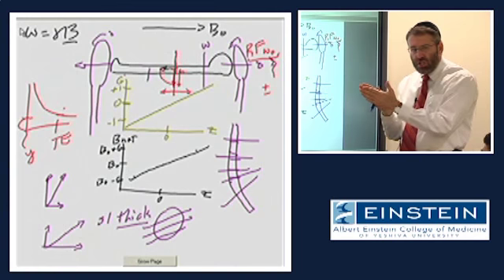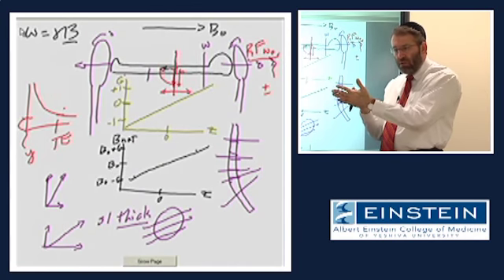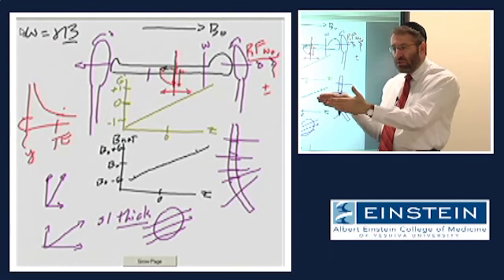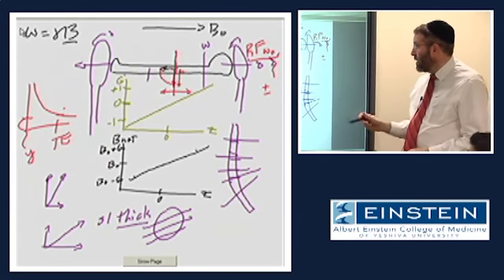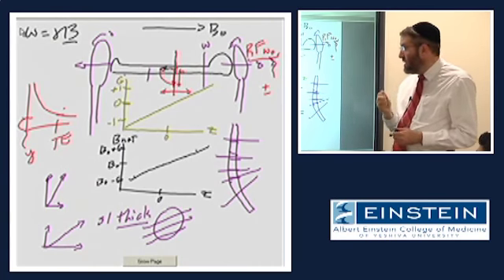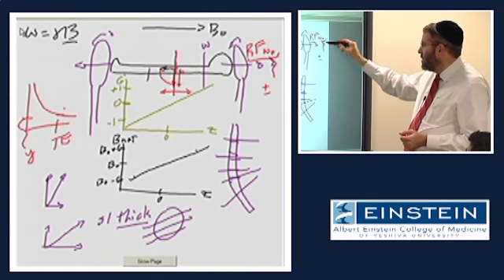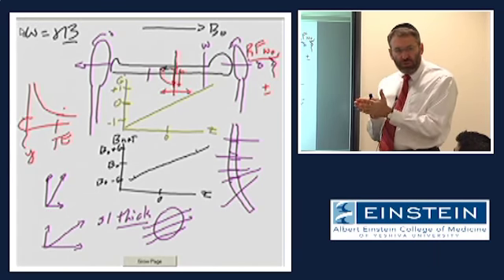So by simply changing the width of the range of frequencies that we transmit in our RF or B1, we can determine the slice thickness.